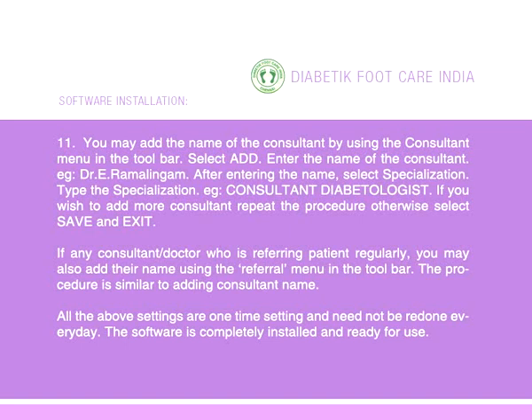If any consultant or doctor is referring patients regularly, you may also add their name using the referral menu in the toolbar. The procedure is similar to adding a consultant name. All the above settings are one-time settings and need not be redone every day. The software is completely installed and ready for use.